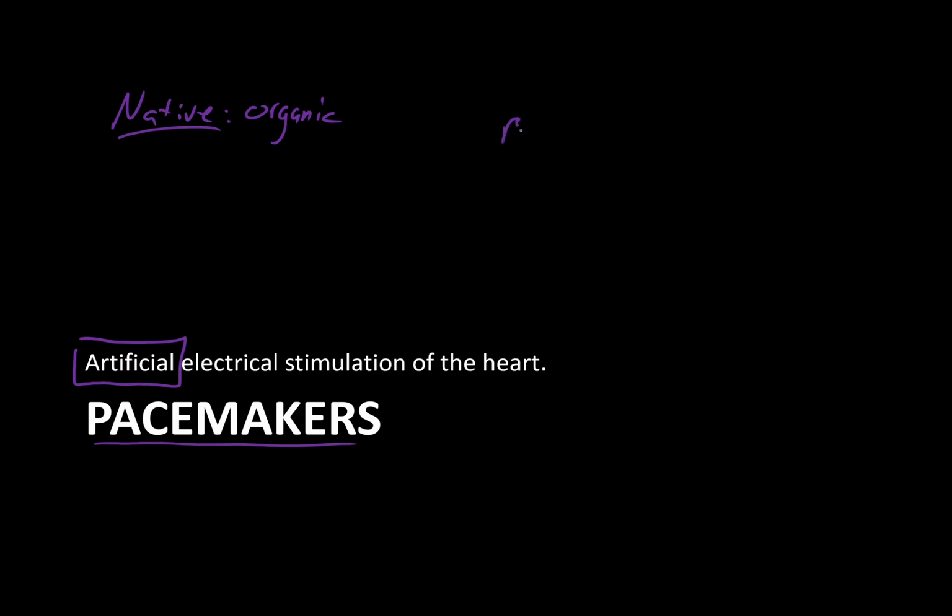For the basic arrhythmia group, the focuses I have for you is going to be the terminology, common rhythms, and by common rhythms, you can almost think of that as common functions of pacemakers, things like being atrial paced, ventricular paced, AV paced. In some cases, patients have demand pacemakers where their underlying rhythm is okay most of the time, but occasionally that pacemaker needs to kick in to help make up the difference.